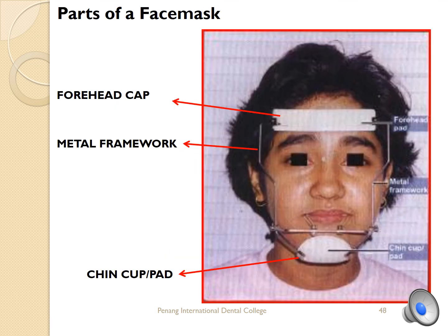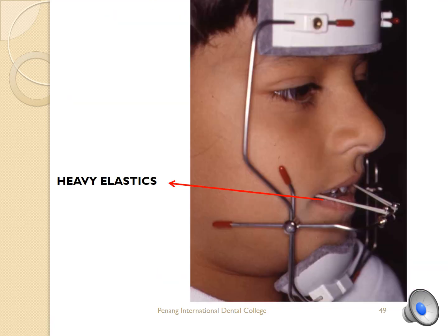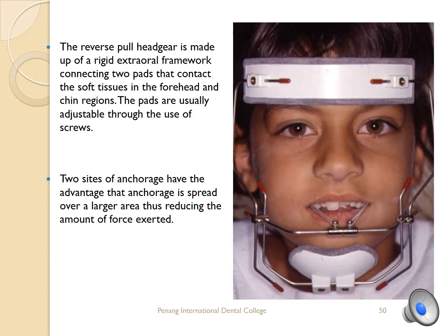This photo shows parts of a face mask. First is a forehead cap, then the metal framework and the chin cup or chin pad. These are the heavy elastics that connect the face mask to the teeth. The reverse pull headgear is made of a rigid extraoral framework connecting two pads that contact the soft tissue in the forehead and chin region. The pads are usually adjustable through the use of screws.